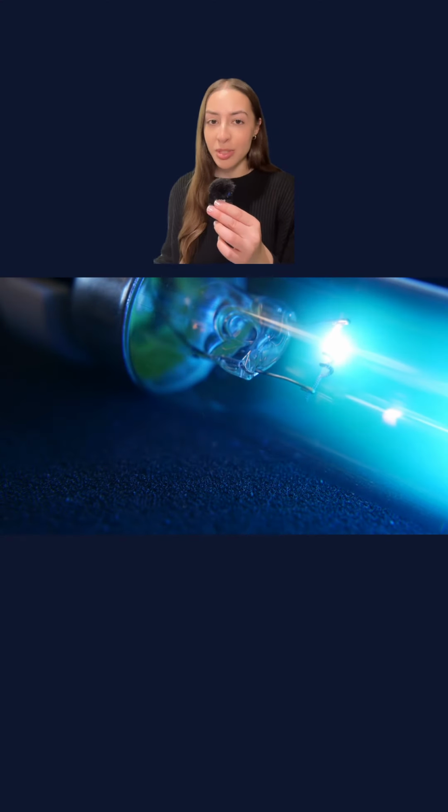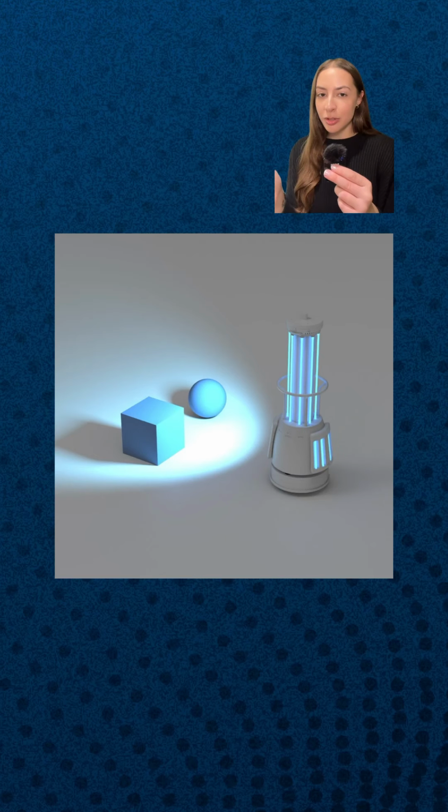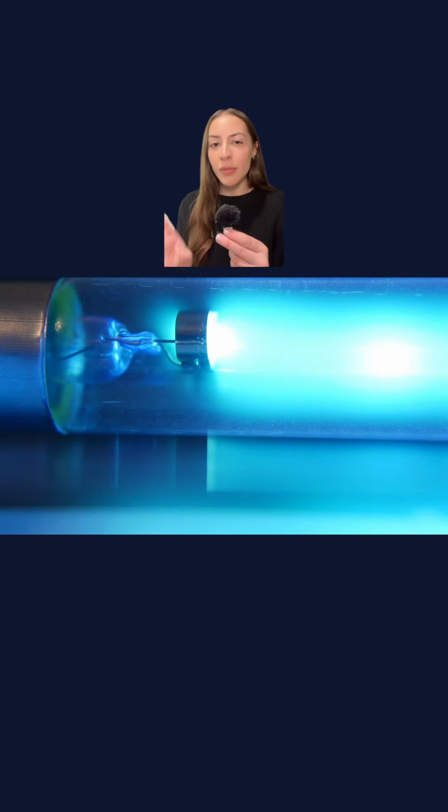On the other hand though, single-wavelength UVC devices offer a steady, consistent output of light. This consistent exposure is necessary to form enough DNA damage to stop microbial replication, and it also minimizes the risk of shadowing, where microbes in crevices or behind objects don't receive adequate UV exposure. Overall, single-wavelength UVC devices are just more consistent and predictable.